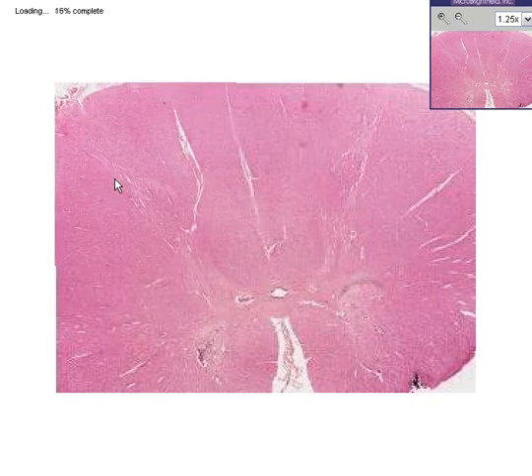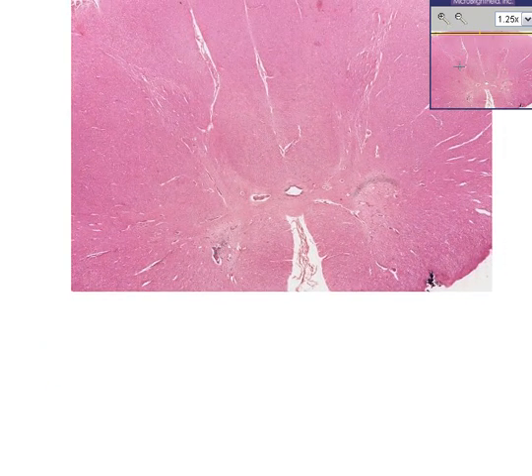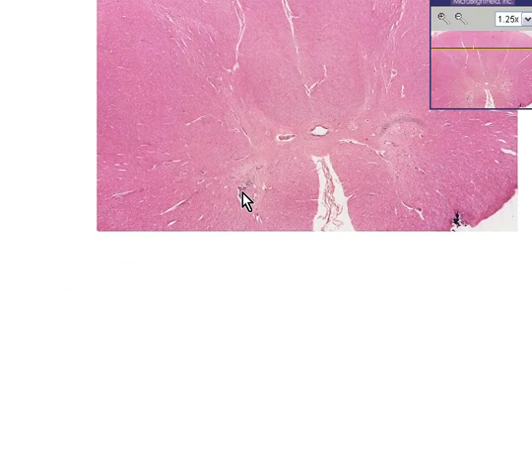Well, let's take a look at the spinal cord. Notice in the upper right here, this is a spinal cord. This cleft represents the anterior or ventral portion of the spinal cord. And so the gray matter is generally oriented along here, and these would be the regions of the anterior horn cells. So take a very close look at this area here, and we'll blow it up.